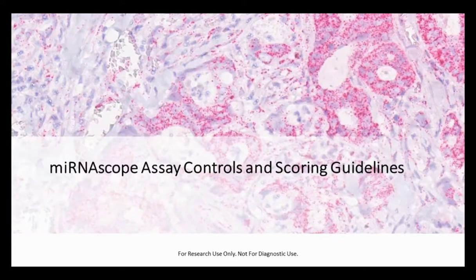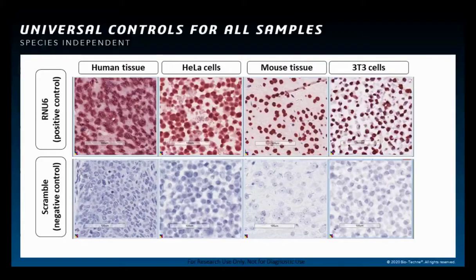Thank you, Miguel, for the excellent application demonstration. In the next few slides, I'll talk about our recommended assay controls and scoring guidelines for the miRNAscope assay.